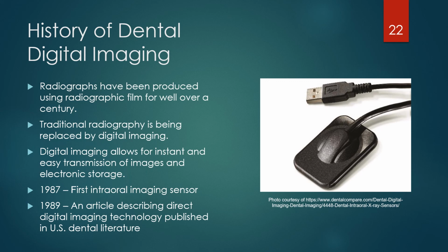Digital imaging technology has become widely accepted and has evolved with improvements in the sensor design and supporting technology. Here at Concord, we use mainly digital imaging. You will take at least one x-ray with film, but that will probably be the only experience that you have with that. And then you'll do the rest of the x-rays you take here with these digital sensors that we have in clinic.